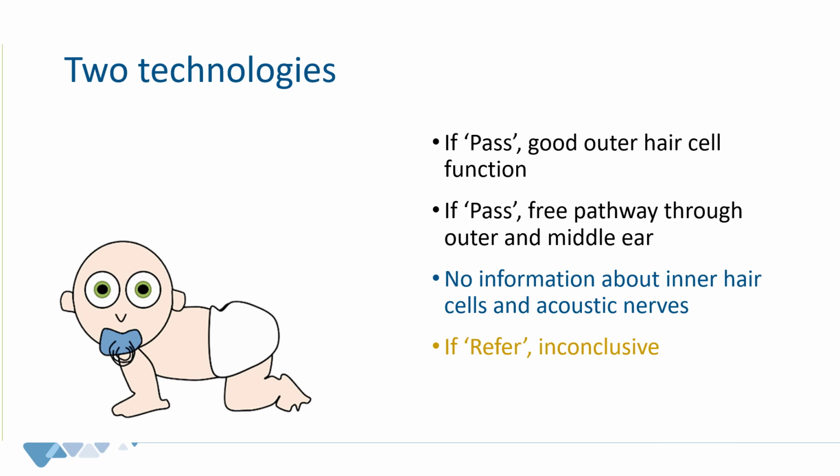You need to be quite good to judge all the circumstances: did the probe fit properly? Could there be minor middle ear something? Could there be something affected by the noise? Could there be misfortune of other types? There are so many small things that can be in the way of measuring OAE. If you don't measure it, you cannot really say there is a big chance of the ear being bad. That's only possible if you've done a diagnostic test and you know really what you're looking at, and you can make an interpretation of the technical side of the measurement.